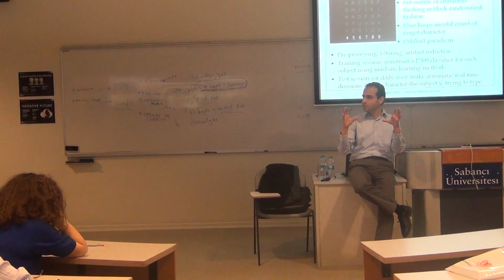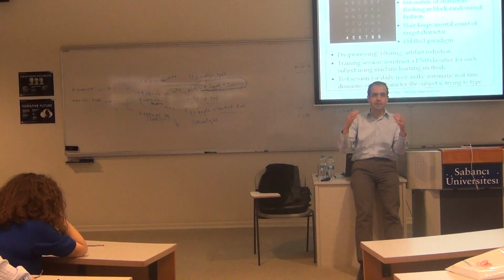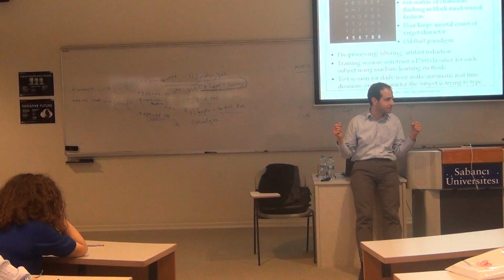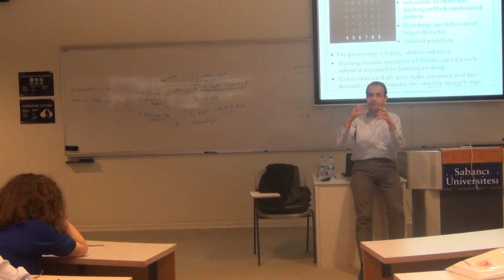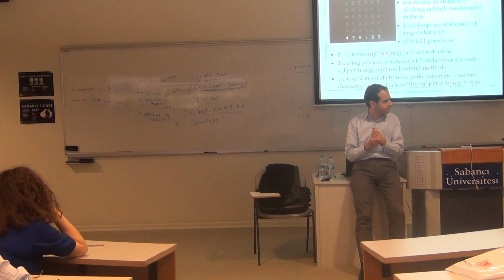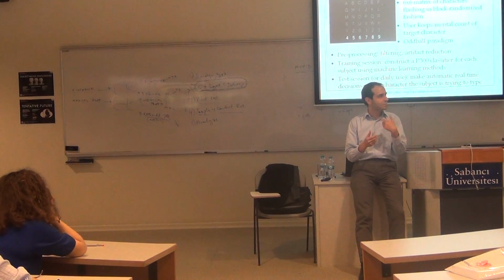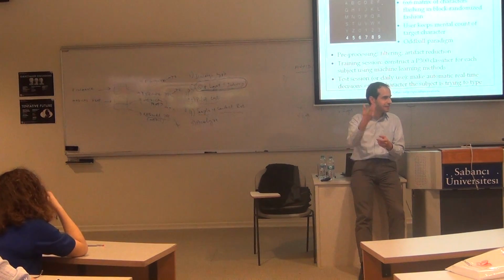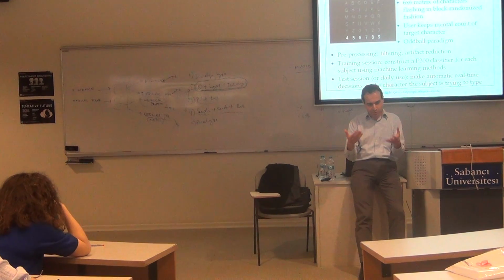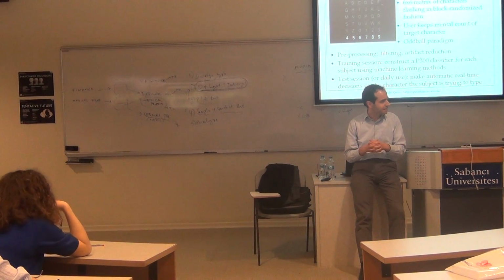Based on just one recording of the signal, you may not be able to differentiate. So our classifier, our algorithms work in the background. They compute probabilities of each row, probabilities of each column. And then from those, we compute the probabilities of each of these 36 characters. Then, if there's a clear winner, our algorithm declares the result. However, if the algorithm is unsure, then it basically displays the rows and columns once more, and then gets more data. And whenever it's confident, then it declares the result. So basically, the signals of the person really determines, in part, how fast this will go as well.